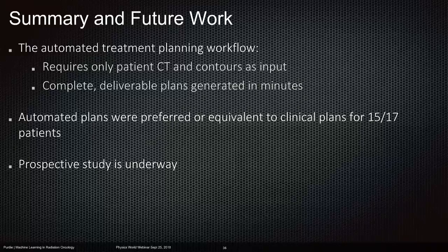Okay, so are the likely dose distributions based on accelerator beam models for a specific clinic? Does the machine learning have to be done for every institution separately? No, that's a great question. So the short answer is no. I think you want to match, of course, site and modality and things like dose.